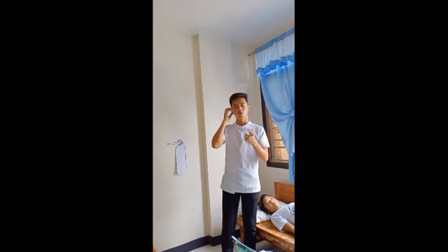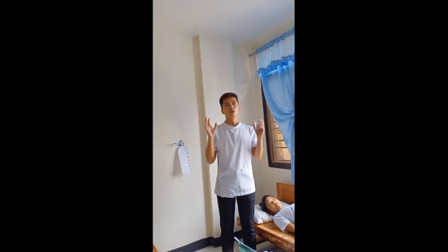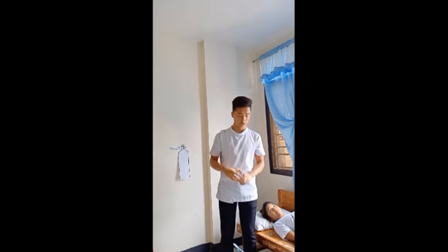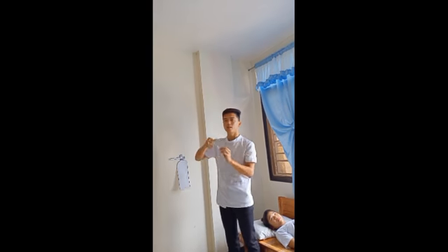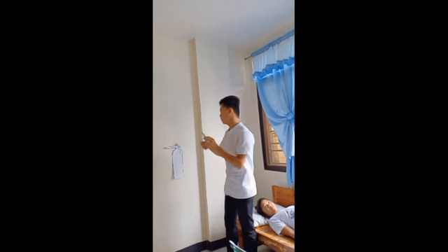Then I'm going to fill the humidifier based on the meter, which is this flow meter. The flow meter is used to set the correct dosage of the flow of air given to the patient. Okay. Let us put the flow meter on the oxygen tank.